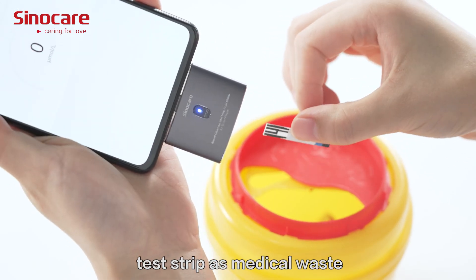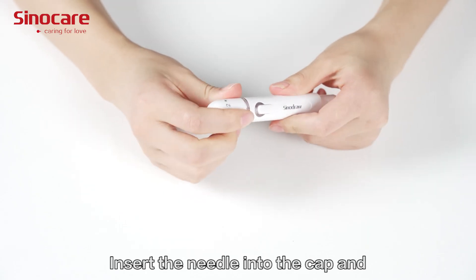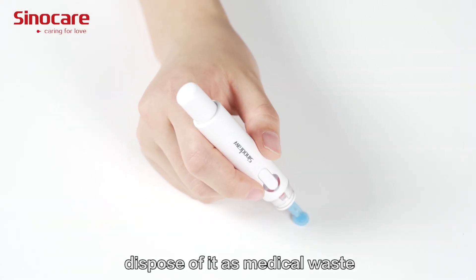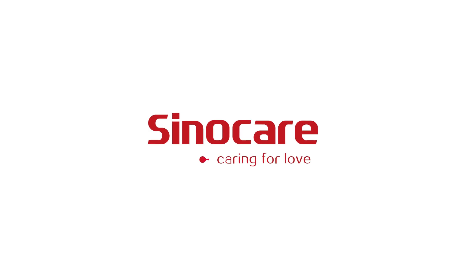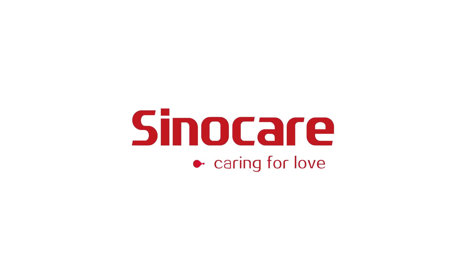Please dispose of the test strip as medical waste. Insert the needle into the cap and dispose of it as medical waste. SinoCare — Caring for love.